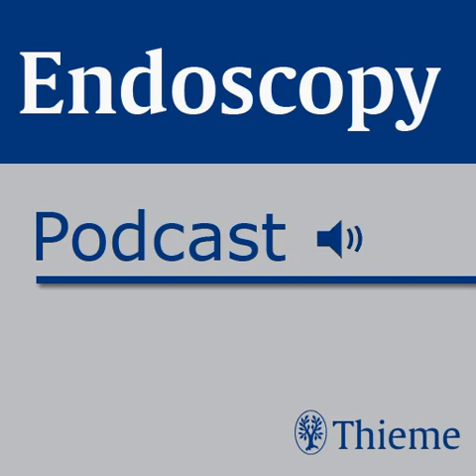Background and study aims. Difficult biliary cannulation and unintentional pancreatic duct cannulation are thought to be important contributors to pancreatitis occurring after endoscopic retrograde cholangiopancreatography. Our aim was to compare and evaluate the rates of success and complications of transpancreatic precut papillotomy, TPPP, and the double guidewire technique, DGT, both with prophylactic pancreatic stenting.